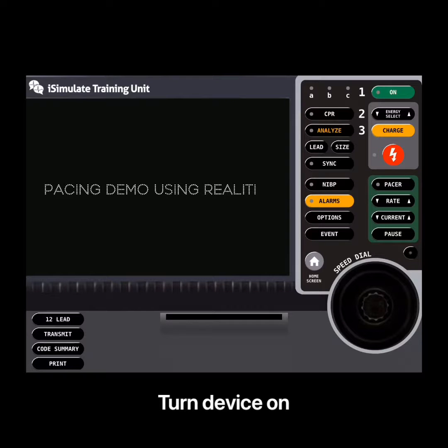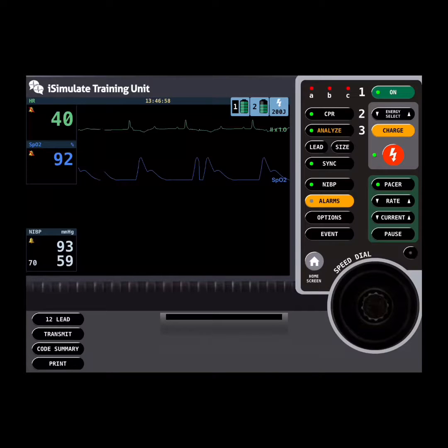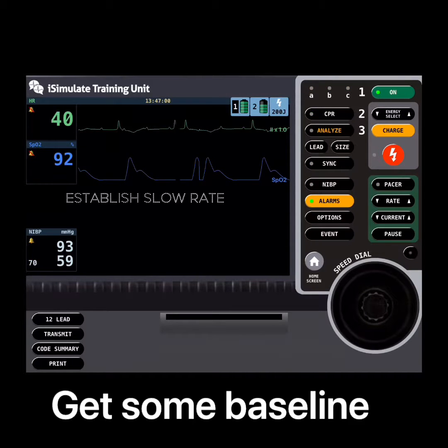Today I've been doing some teaching using the LifePak 15 unit on the iSimulate Reality. I thought I'd capture some video at the same time and show you how I was using it.